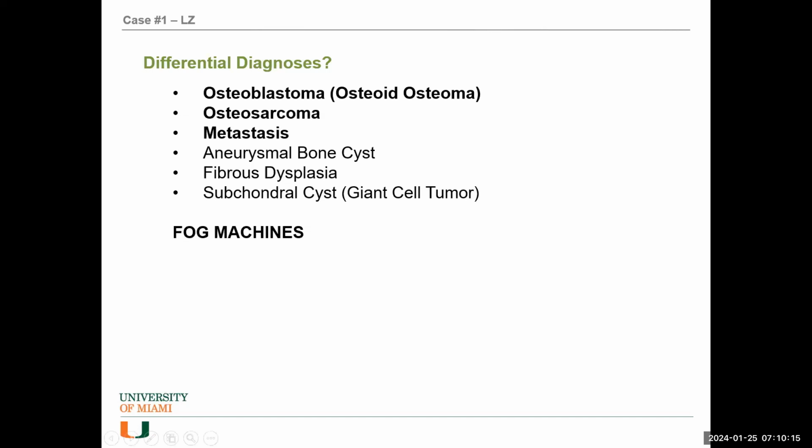We're going to be looking at all these different differentials. Fibrous dysplasia, there's a possibility. Osteoblastoma / osteoid osteoma. This is just a differential between the size, so these are essentially the same histologically. Giant cell tumors, METs or myeloma. Something to always keep in mind, particularly with this bubbly appearance of sorts, is to consider aneurysmal bone cysts as well.